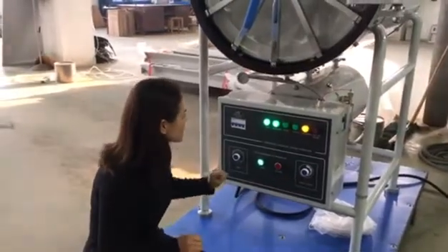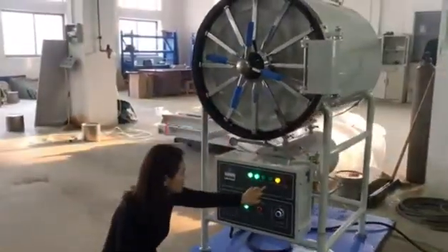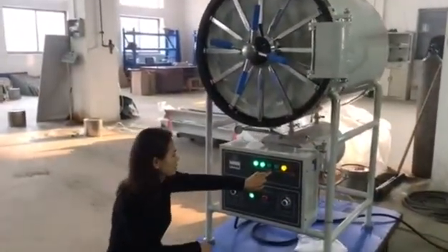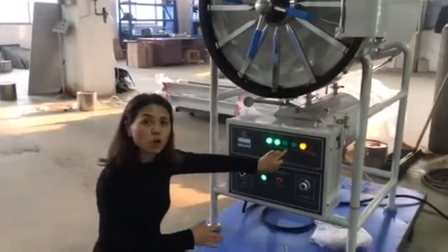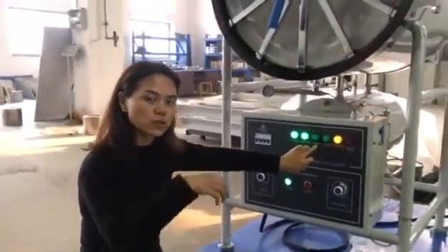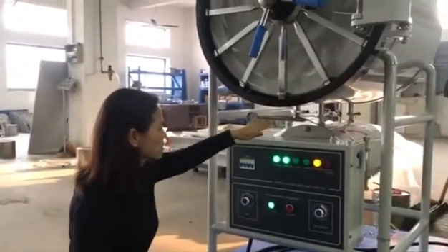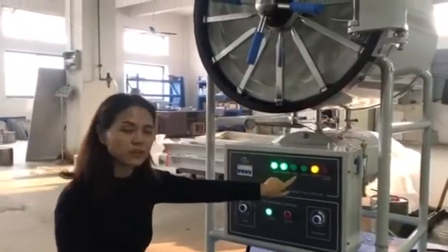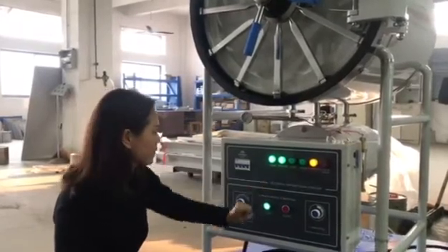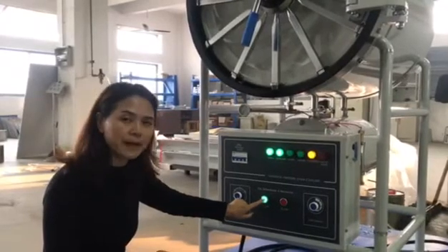Then this machine will start the watering process. You can see that the water button is off. Around 5 minutes, the water will go into the tank. Once the tank is full of water, the button will turn into green. Then we press the start button.